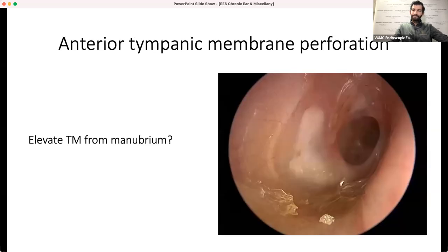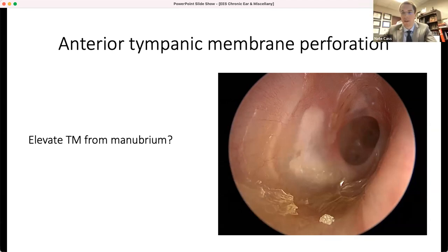Dr. Cass, I think you cut out for just a moment there. Sorry. I think more broad elevation, and then one where you start quite far laterally and you make a very thin tab on your graft. It's almost like a string. So the disruption to the anterior annulus is less in that case. But yeah, I agree that you're certainly putting yourself at risk for a little bit of blunting, but the more dissection you do in that area, the more risk you're incurring.